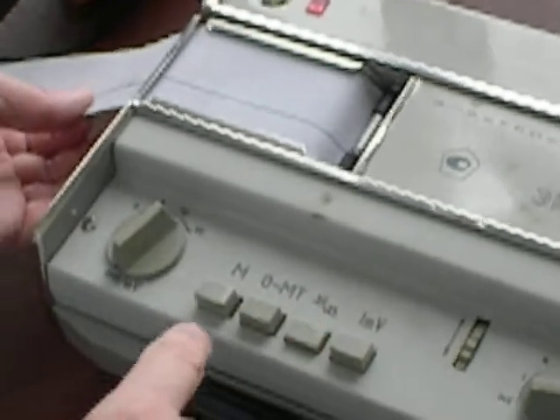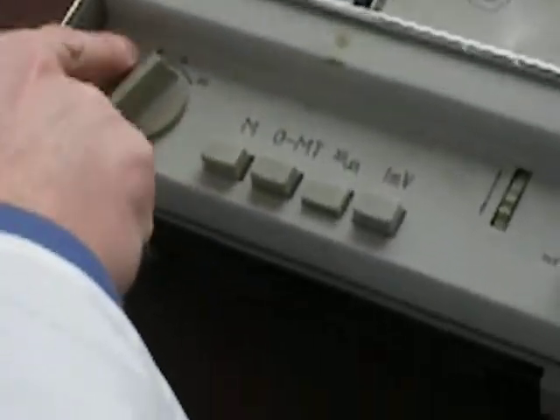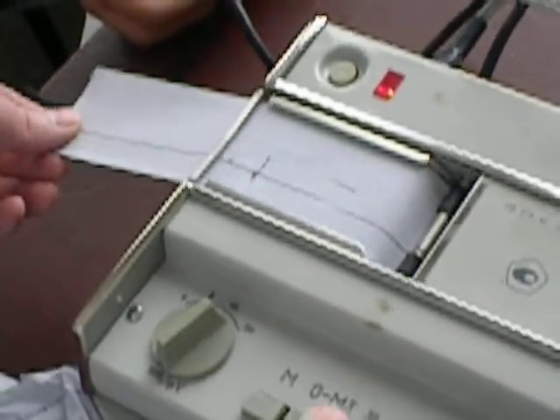So this is one millivolt. Amplification of signal times zero, times five, times ten. So we have to start from calibration. This is one millivolt — a calibrated signal. So we can express everything in millivolts.